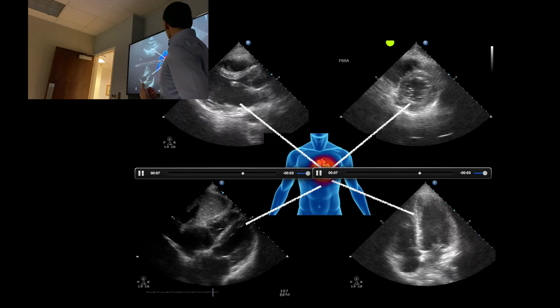In the apical four-chamber view, this side is right and this is left. In a normal patient, the left ventricle should always be bigger than the right ventricle, and the atria should be about the same size. This is where we compare chamber sizes — left versus right ventricle, left versus right atrium. If the right ventricle becomes bigger than the left ventricle, we know something is going wrong.